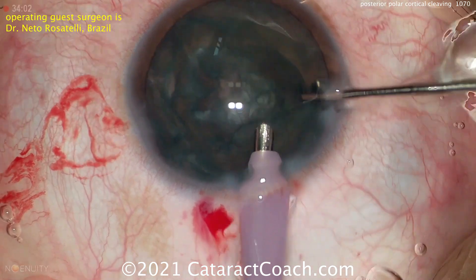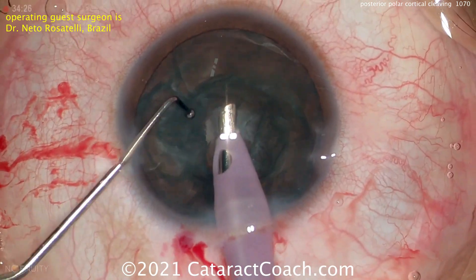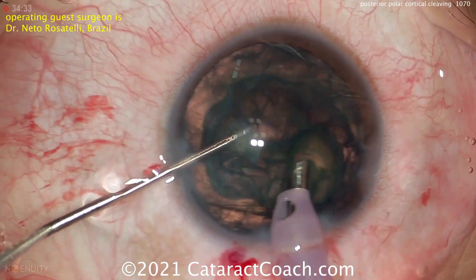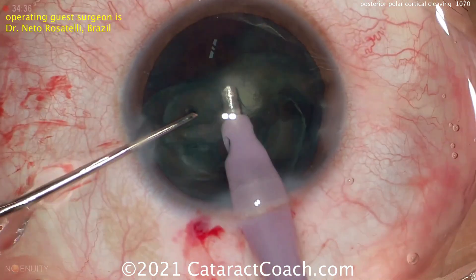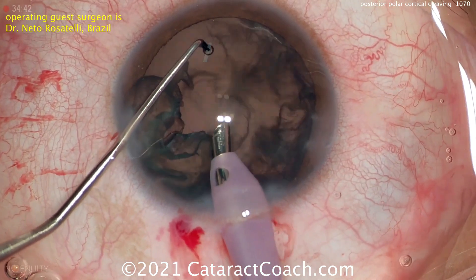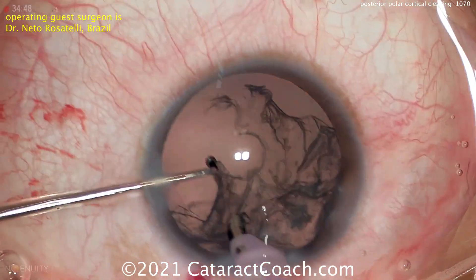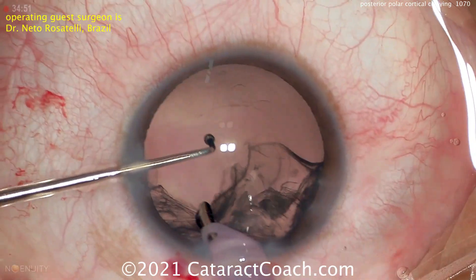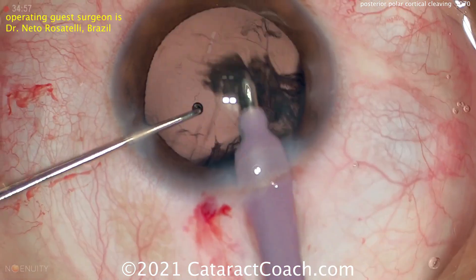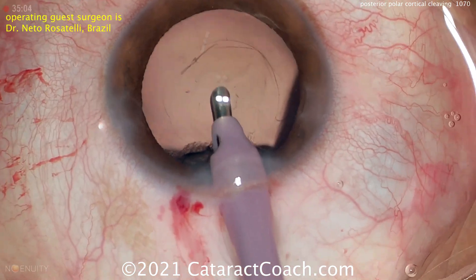This is a mechanical separation — mechanical delineation and dissection at the same time — done 360 degrees. Notice there are two paracentesis incisions. Now that this is done, the cataract can be aspirated quite easily. Spinning it around using high vacuum, high flow, and minimal phaco energy. It's not a very dense cataract, so the whole nucleus and epinuclear shell can be removed. They've already been dissected away from the posterior capsule. If you look carefully at the posterior capsule, you can still see where that posterior polar opacity was attached.